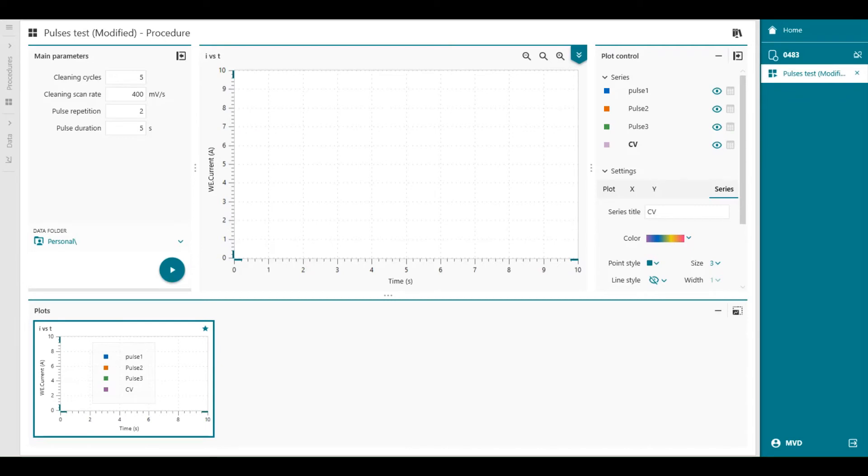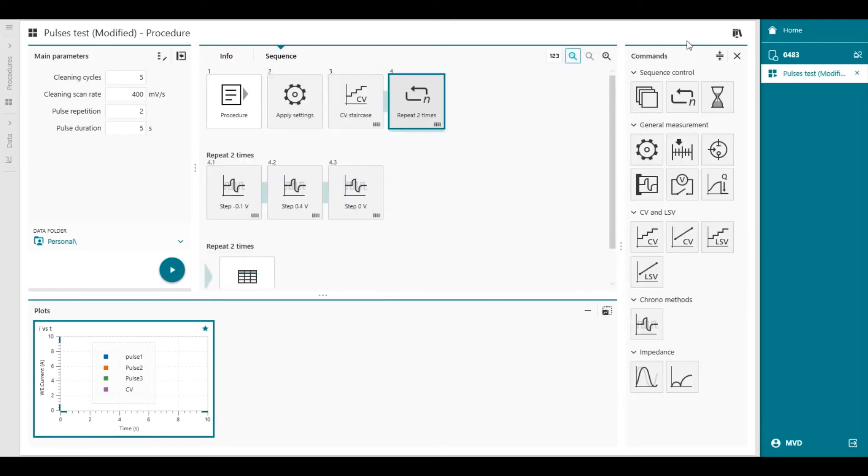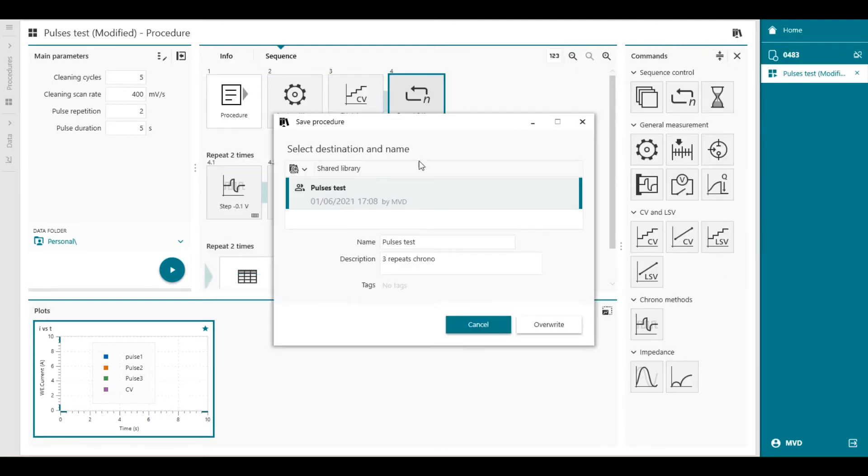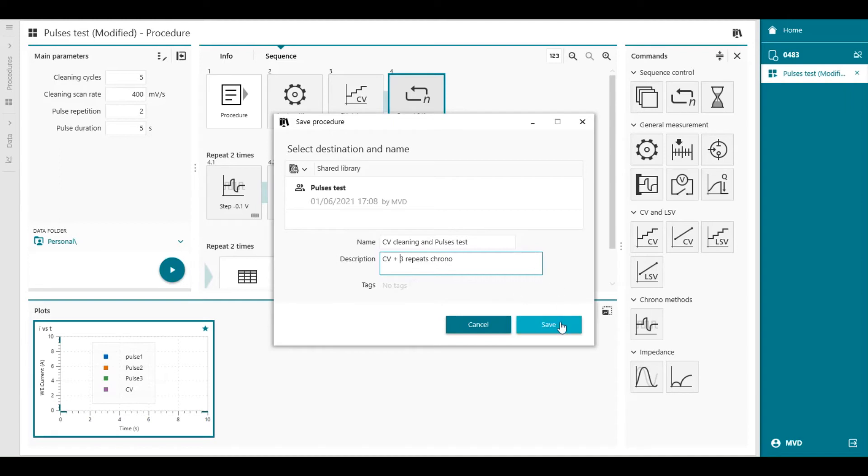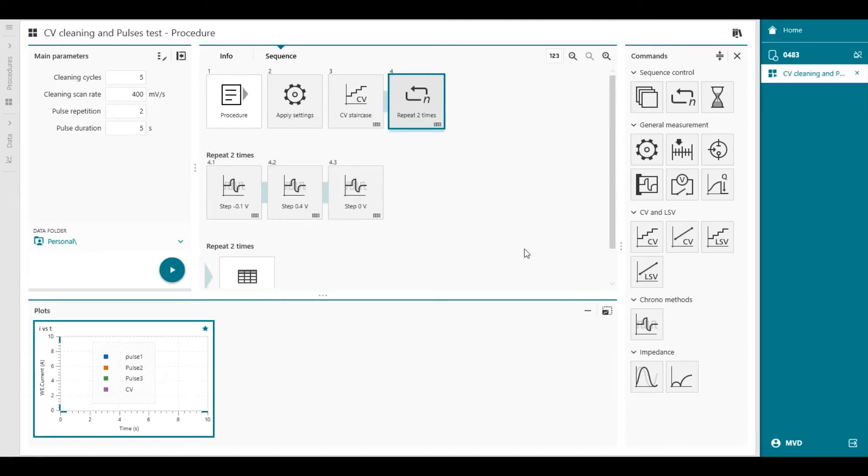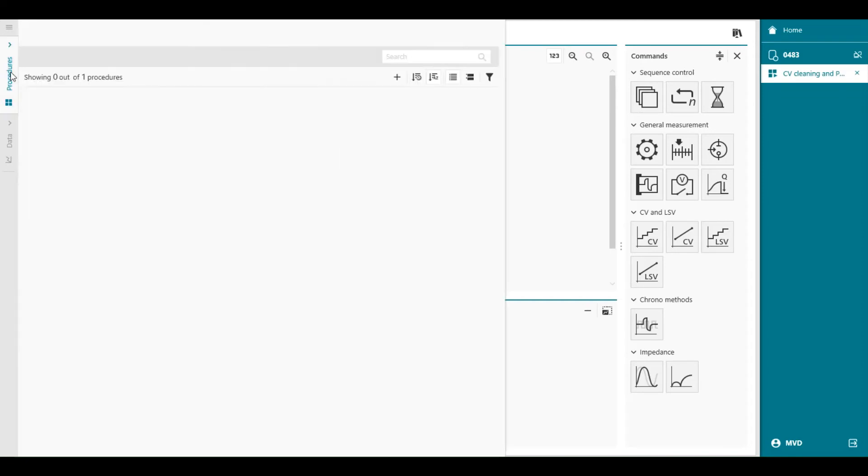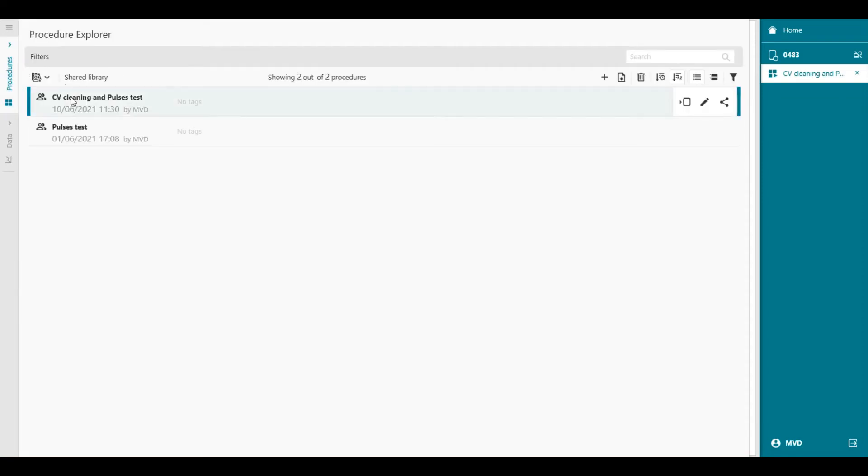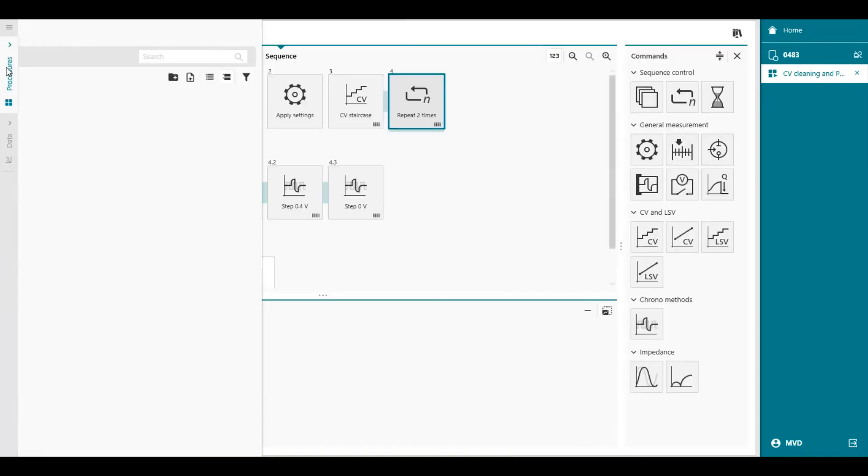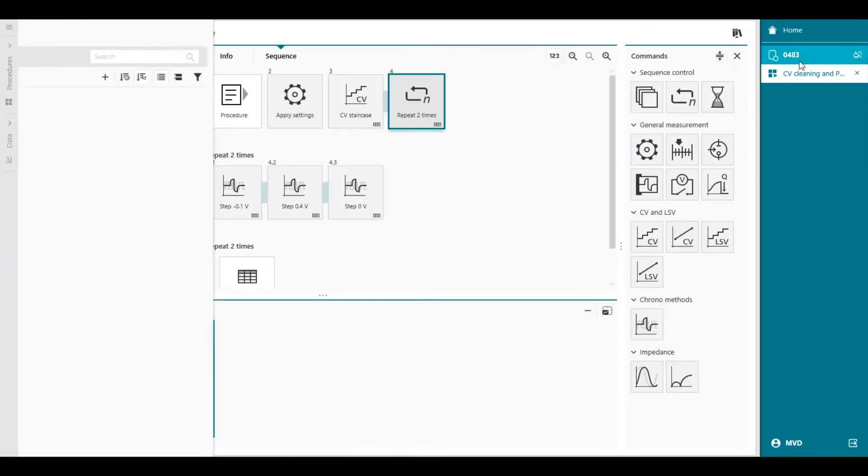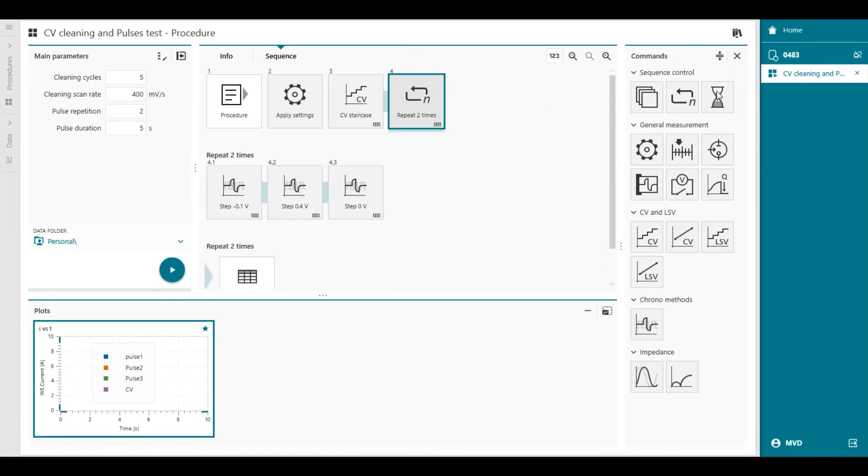Now that we are done optimizing the procedure. Let's save it. We go here, in the upper right corner. Save procedure to library as. And then we can give it a name. CV cleaning and pulses test. So we can say CV plus 3 repeat loop chrono. Save. Now it's saved in the procedures. Here. Cleaning and pulses test. And what we can do now is we can go back to the procedure and we can run it. You can see that the procedure is already loaded underneath my Vionic instrument. The start button is available. And I can start the procedure.